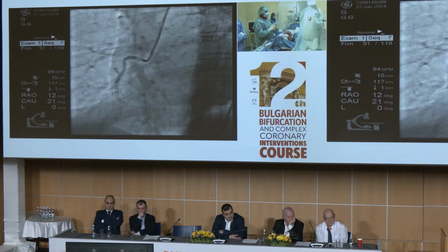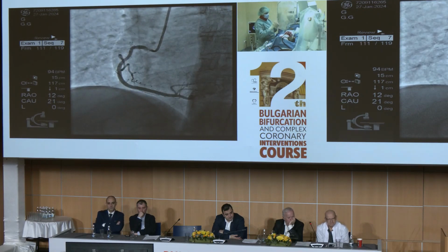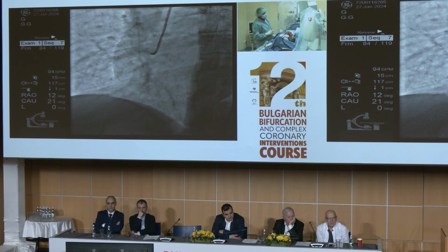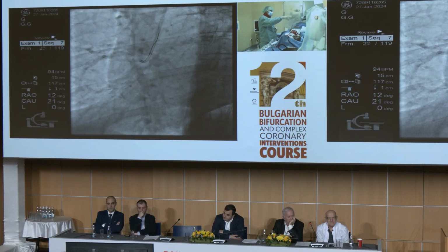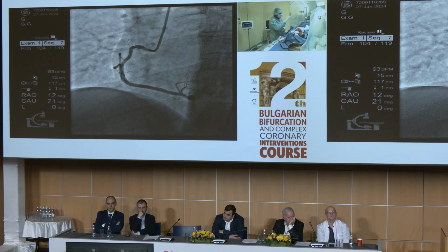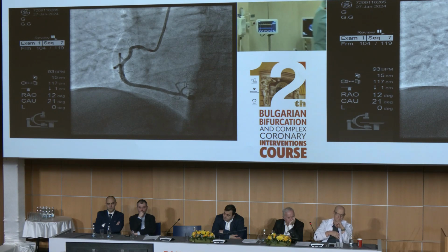It is highly calcified, diseased at the proximal segment, huge artery, more than 4 millimeters, but functionally non-significant. We made the RFR twice. The first one was at the middle of the artery, below the diseased segment, but the result was the same.